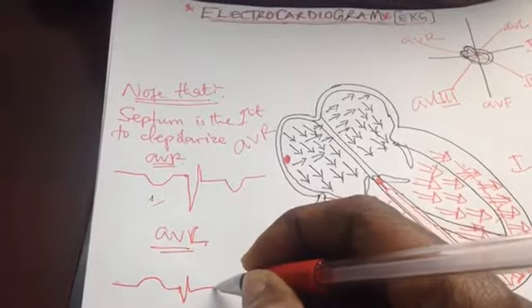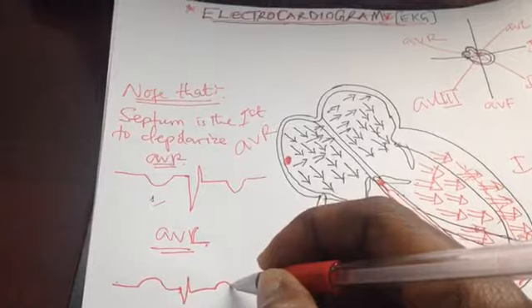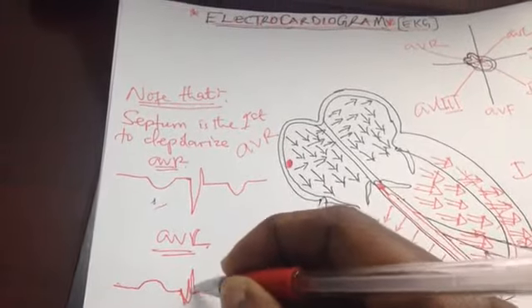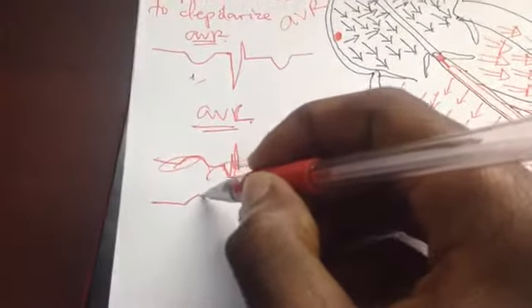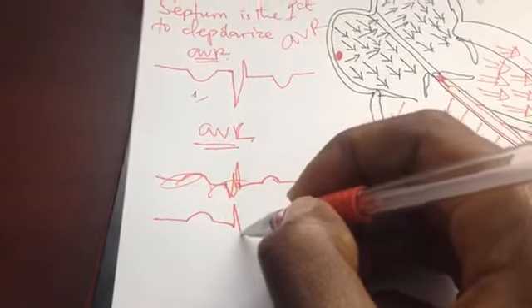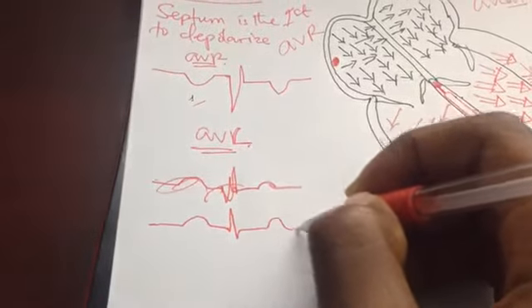The T wave is also going to be, sorry, here it is supposed to be, I want to make it very short. So this is the T wave.